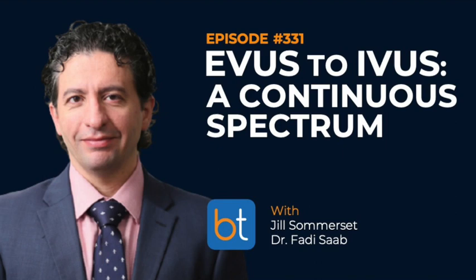But at the end of the day, at least you can go to even the diagnostic lab and request that within your diagnostic evaluation of these patients, you can at least determine the cap morphology for the physician. And I know Jill does that without anybody asking her, because she's already thinking, okay, this patient is going to go to the lab. They have a CTO in the superficial femoral artery. Let me show how the cap looks. Is it concave? Is it convex? Is it a pile of rock, calcium?